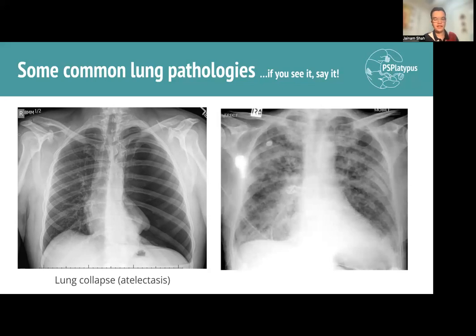Now, just to clarify, these are quite like pathognomonic images. They're kind of exaggerated, so these are the worst case scenarios. You want to be looking out for these in more subtle appearances. But in this case, this is actually quite an easy diagnosis to make. This is pulmonary edema. So you will be able to see a lot of fluid and a lot of congestion in both of the lungs. In this case, we had nice, healthy, more subtle vascular markings. Over here, you can see a lot of fluid just building up in those lungs, right? So very classic of pulmonary edema.